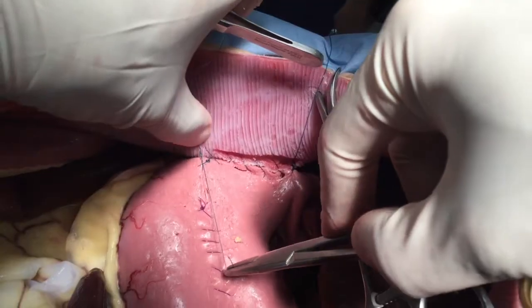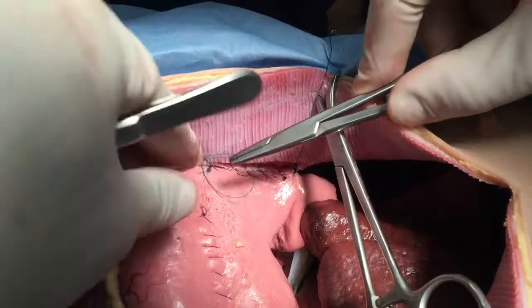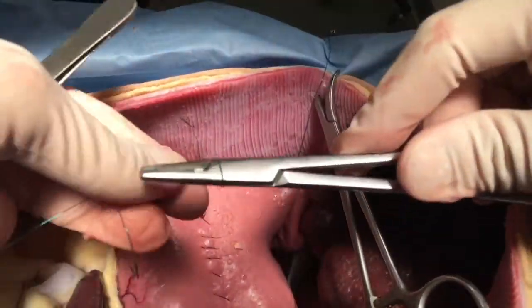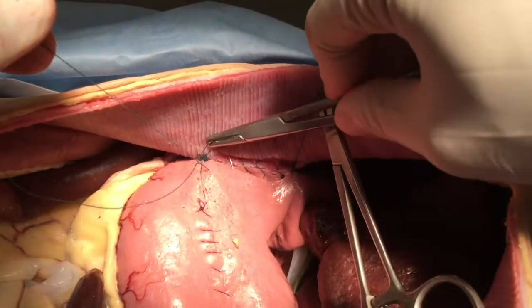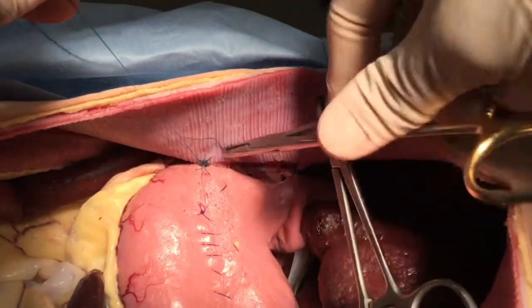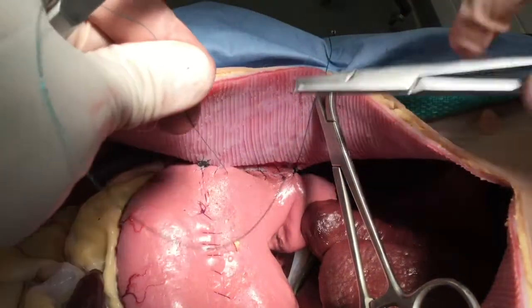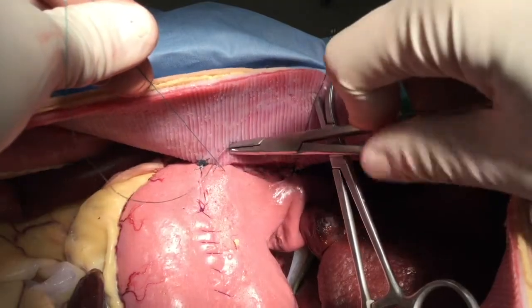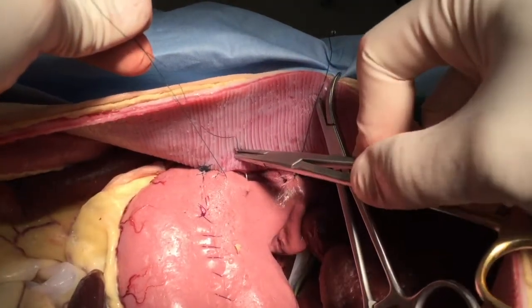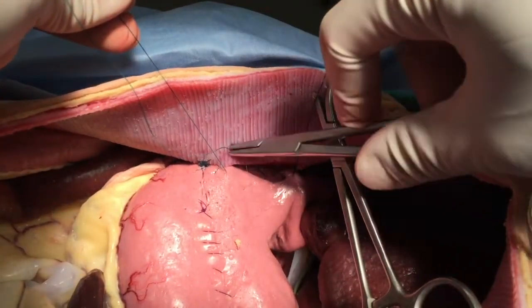At this point, you can start a new strand of suture. With this continuous pattern, we are now opposing the more ventral aspect of the incision. Here you can see that the primary surgeon is, again, maintaining that little bit of tension to maintain good apposition between the tissues as you are taking each bite.